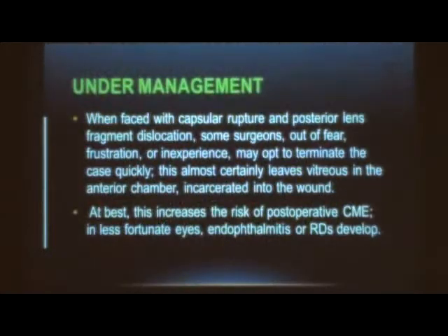So, what are the attitudes of cataract surgeons in such a situation? First, some may undermanage the case. So when faced with a capsular rupture, especially if you do not have enough experience, maybe the first time for you, with a lens fragment that is posteriorly dislocated, some surgeons, out of fear, frustration, inexperience, may opt to terminate the case quickly. This almost certainly leaves the vitreous in the anterior chamber incarcerated into the wound. At best, this increases the risk of postoperative cystoid macular edema, and in less fortunate eyes, endophthalmitis and retinal detachment.